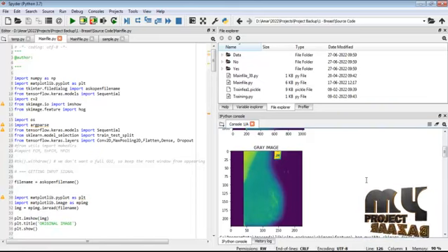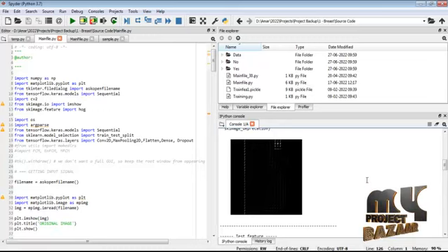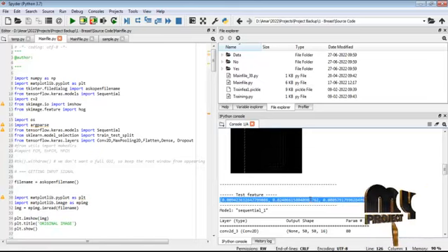After converting into grayscale format, we have to extract the features from the image. In the flow diagram, we discussed two kinds of features: one is the HOG and the second one is the CNN. This is the image for the HOG features. After extracting the HOG features, the extracted feature values are displayed like this. These are the features we extracted from the HOG.